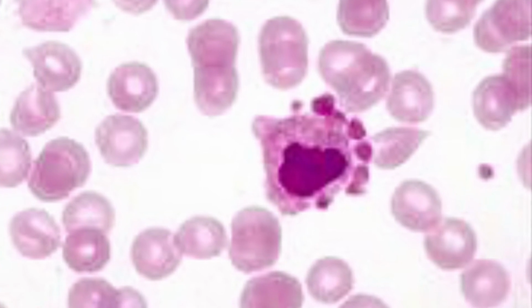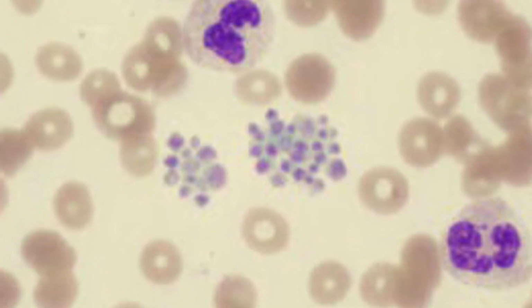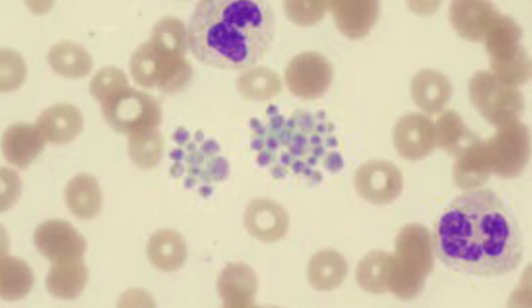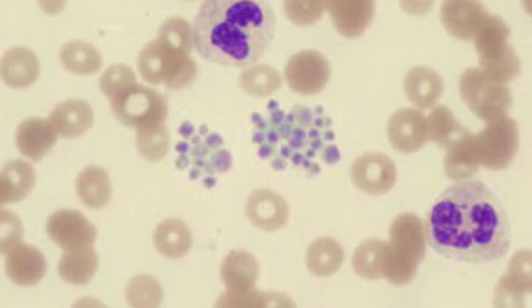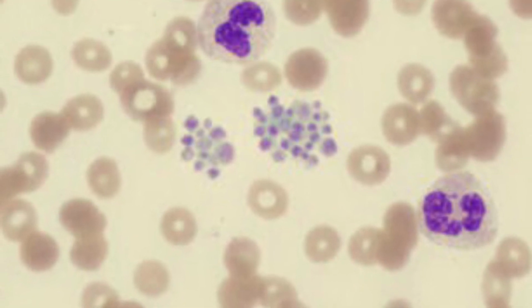Another cause for pseudothrombocytopenia is platelet clumping, where platelets aggregate and clumps are seen. This, as in platelet satellitism, causes an artificially low platelet count due to lower numbers of free platelets in the EDTA blood as counted by the analyzer.